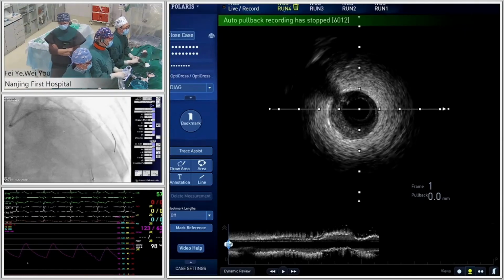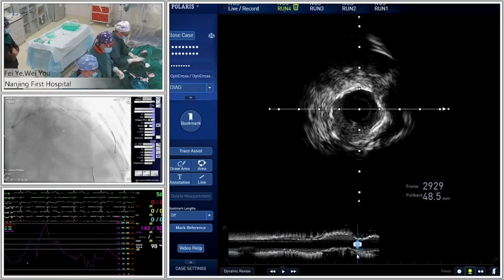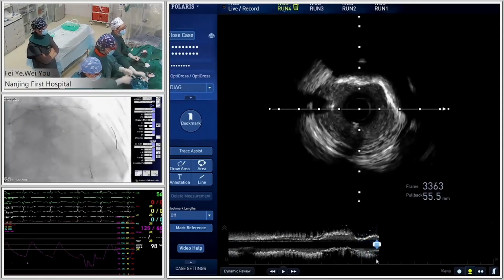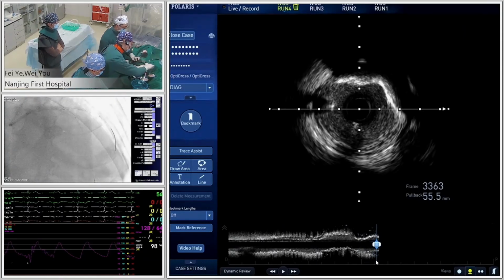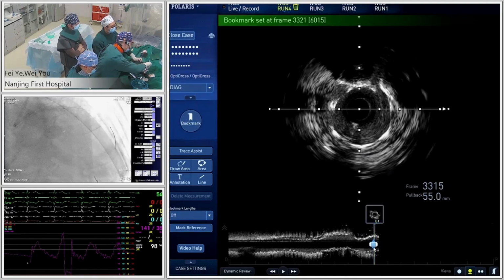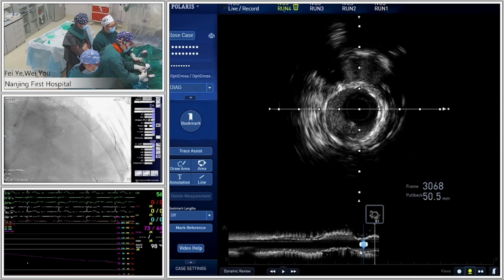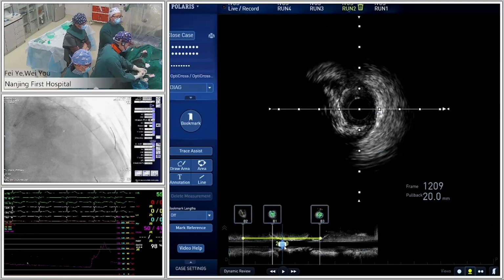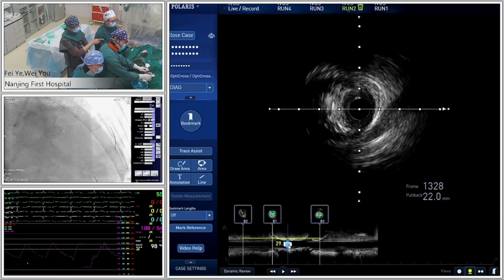I will stop. Stop IVUS. Okay. After we give the... Give me ATP. ATP. Okay. I think the flow will recover. It's very interesting. ATP. So, Dr. Pan, would you show me the original IVUS result of the side branch? There is an attenuation. This is the side branch. Yes. The original diagonal branch. So Chief, you want to see the plaque characteristics? Yes, attenuation plaque. Yeah. Here.